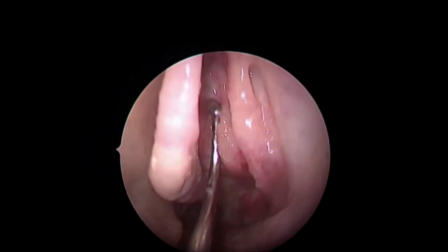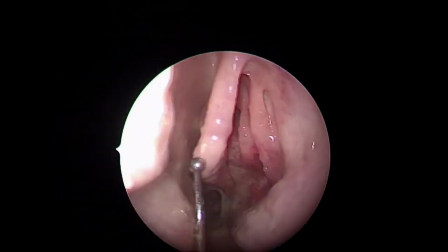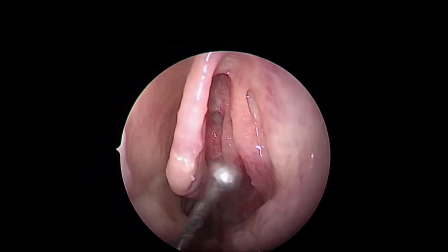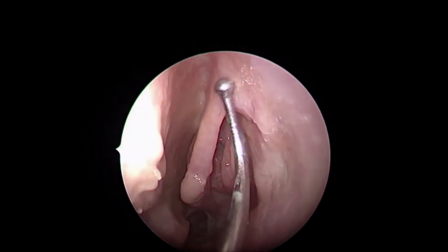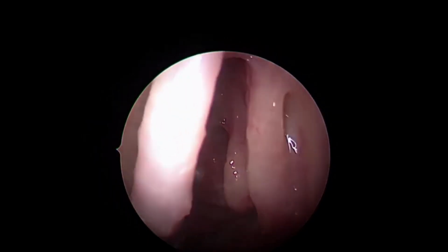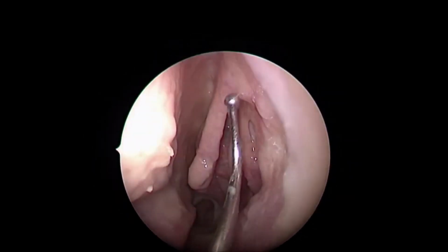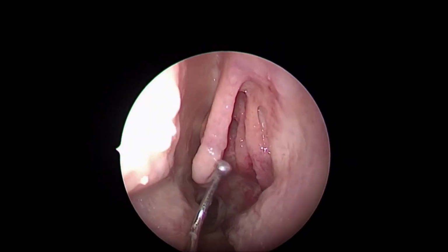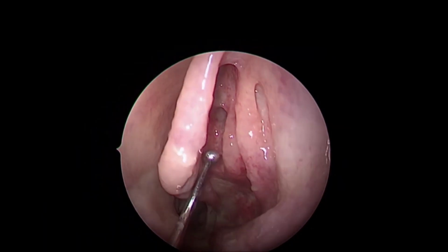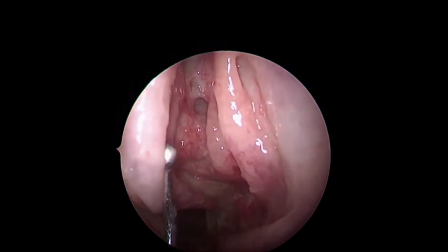So now, coming to the most important anatomy for the sinus surgeon, which remains all the way and which is required to be understood and respected and maintained, is the middle turbinate. This middle turbinate is one of the most important structures you can see in this part of the nose. It has practically three parts in three different planes contributing to its stability. This is the most important structure which orients us throughout the sinus surgery, and stability of this structure is very important.